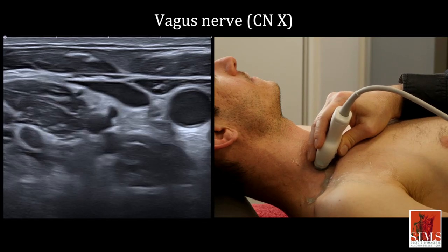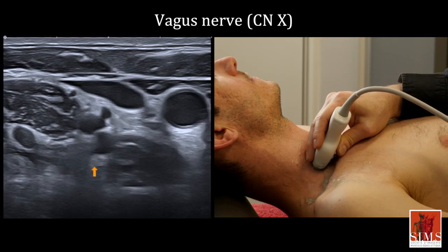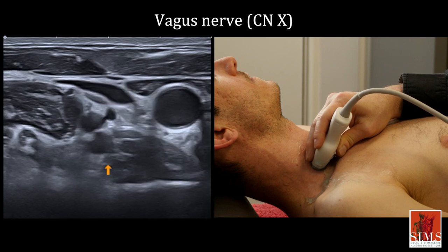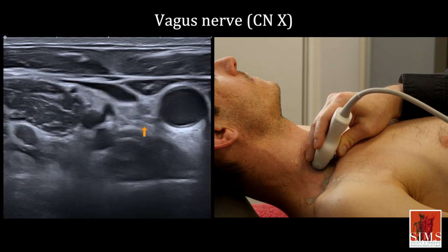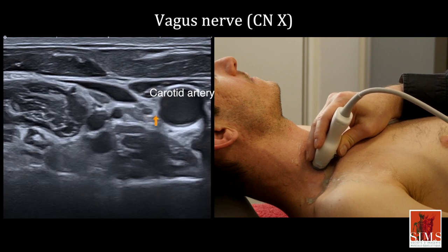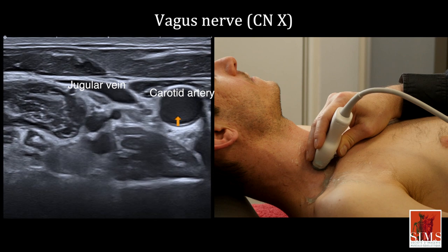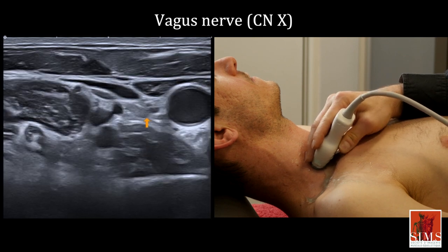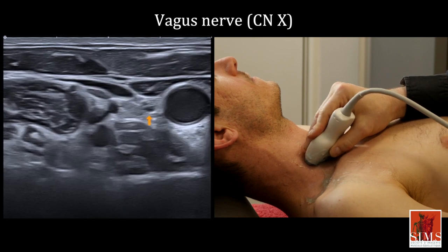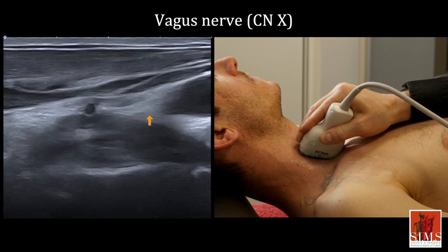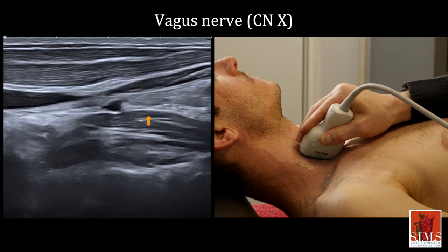Now we are going to study the smaller cervical nerves. The vagus nerve CN10 is between the carotid artery and the jugular vein. These two vascular landmarks make it easy to spot here under the arrow, and here in a longitudinal view.